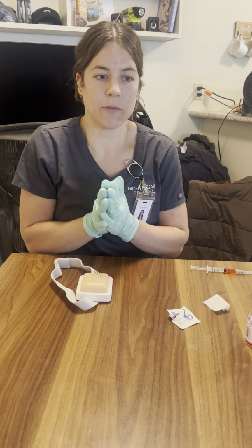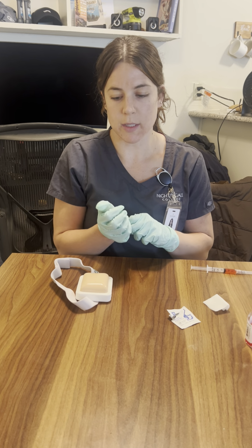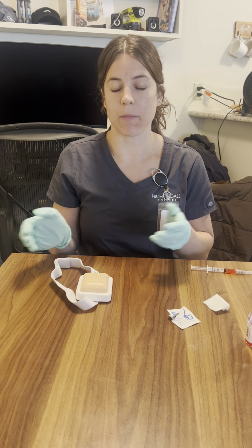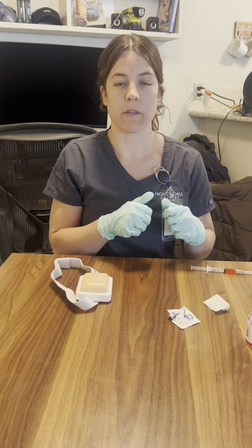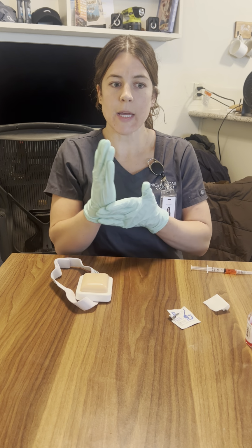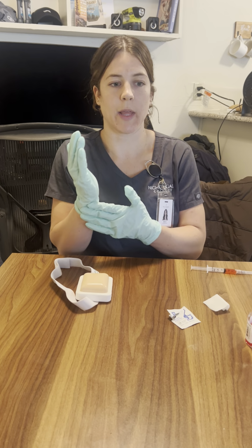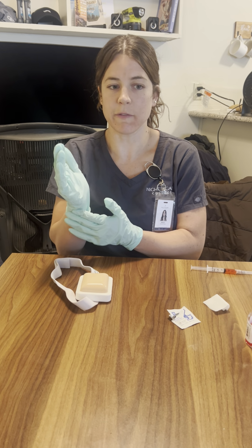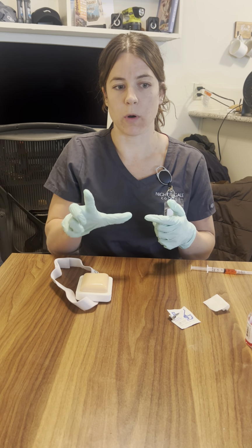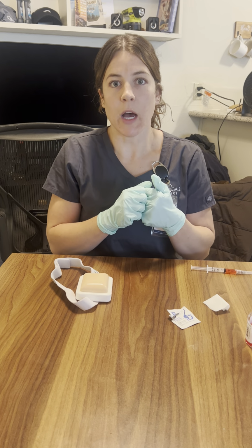Alrighty, after we've done that, we need to select the site of injection. So for this patient, we are going to go ahead and have them lay on their side, and we're going to do the ventrogluteal site. So to identify that, we're going to use the heel of our hand and run it along the greater trochanter, making sure that my wrist is perpendicular to the femur, pointing the thumb up to the groin, and then our injection site's going to be right in the V of our fingers.